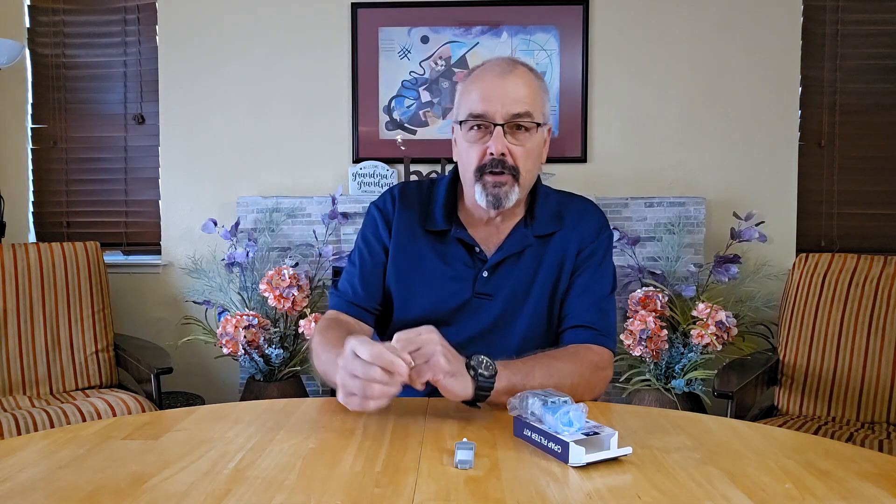For you, a CPAP user tired of dealing with stale filters — Scott here, and today we're looking into a handy replacement kit for the Philips DreamStation 2 that could make your CPAP routine a whole lot easier.